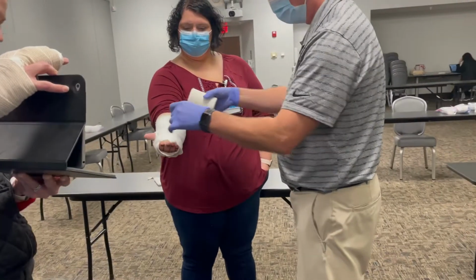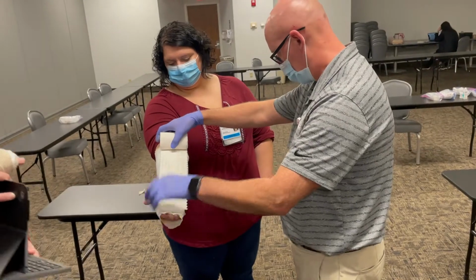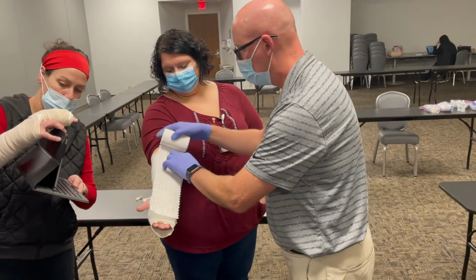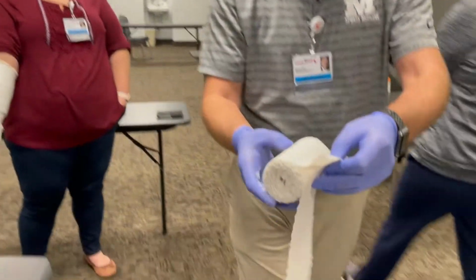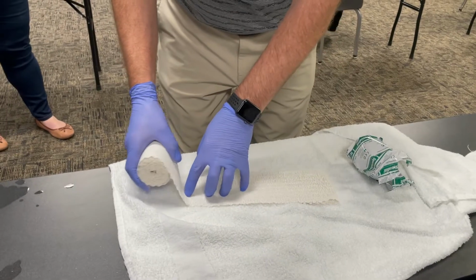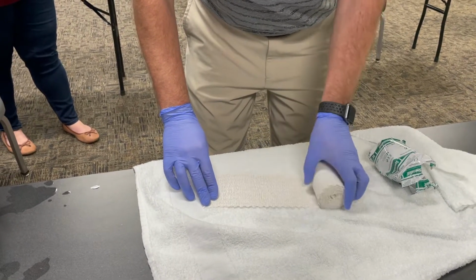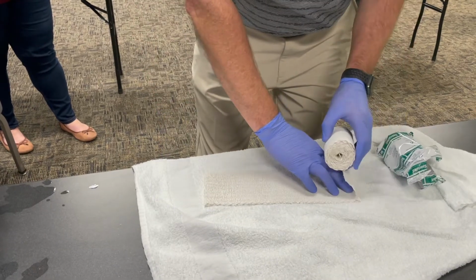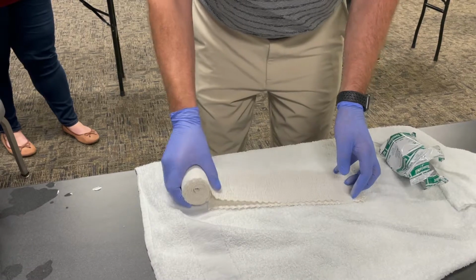Hope I don't get it on her. So about there. And we're going to go to about there. See that? And you just make your crease there. And I'm going to come back over here. And then I usually do about 10 layers on this. So 6 to 10 padding, 10 layers. Yeah, that's plenty. And you just kind of fold it and just go back and forth.